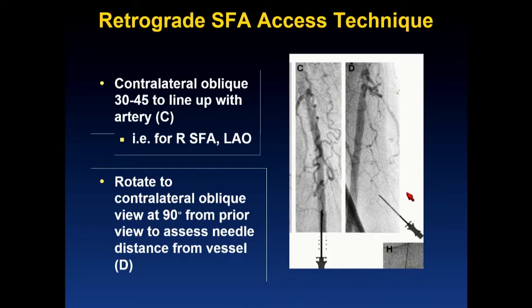And I think one key to doing this access successfully, as was mentioned this morning, is you want to have an angle that's not too steep, because if you are aiming straight down into the vessel, it can sometimes be difficult to advance the subsequent wire and or dilators.